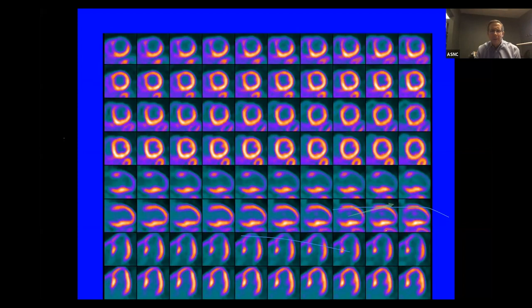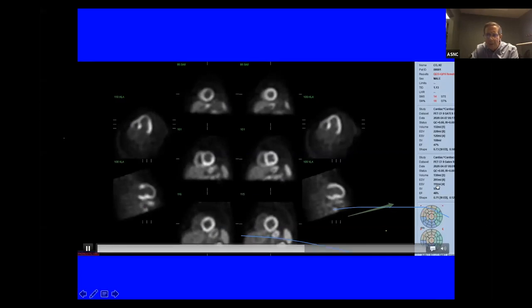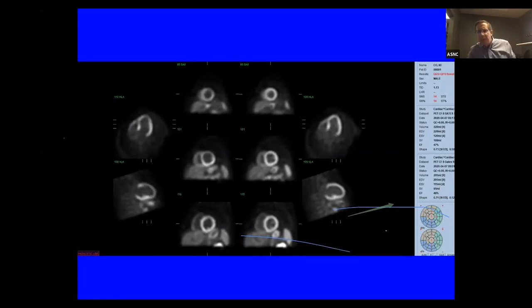You've got TID. This heart's dilated, by the way. You may not know from your scaling, but from our way of looking at it, we do. Your ejection fraction is 46% at rest, and 47% with stress. This is PET, so while the patient is undergoing regadenoson and stress, you're acquiring the stress images. If you're not sure of the scaling, or it's someone else's scan, or you're not used to it, you can look at this number here.